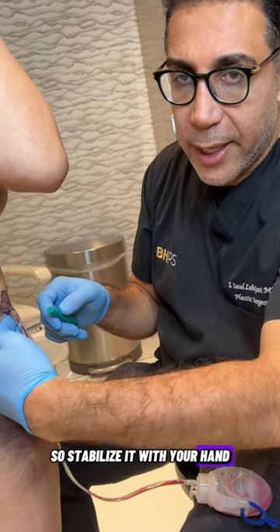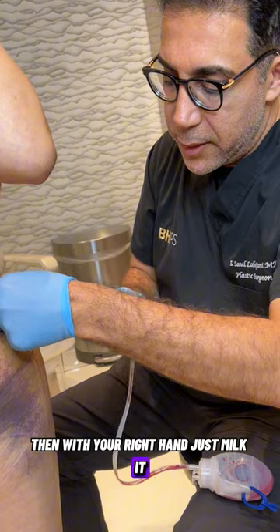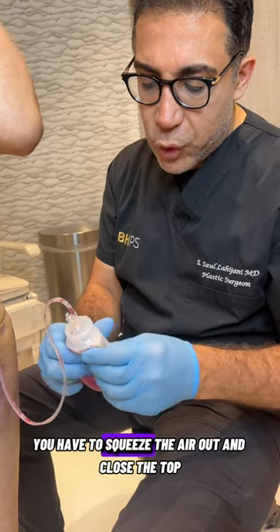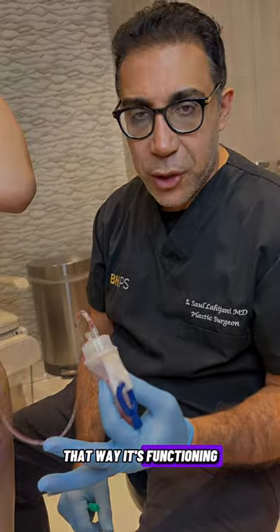So stabilize it with your hand. Then with your right hand, just milk it. Don't forget if it's open, it's not working because there's no suction. You have to squeeze the air out and close the top — that way it's functioning.